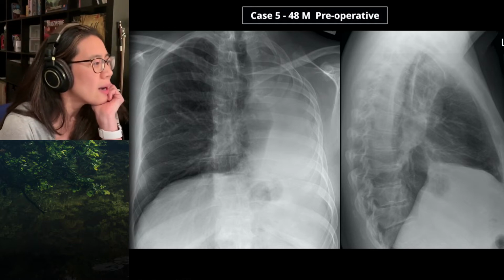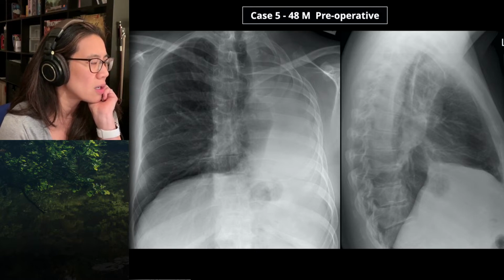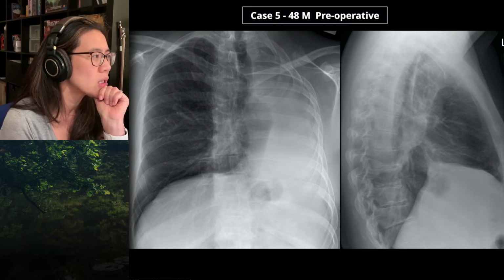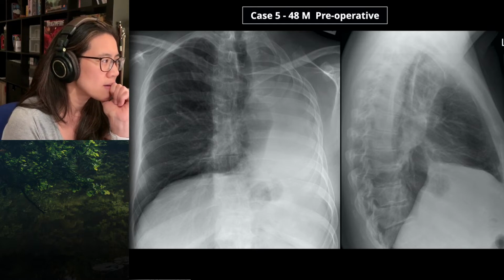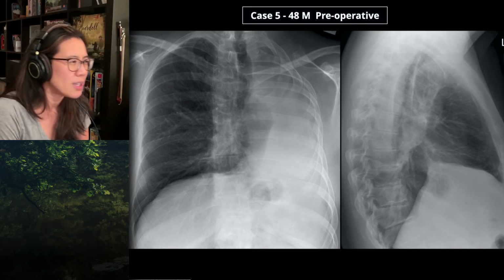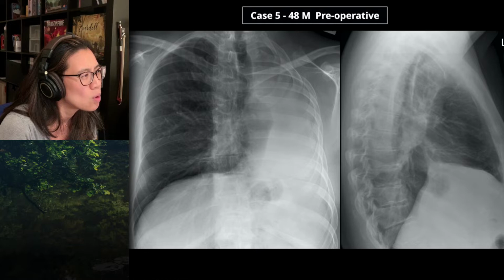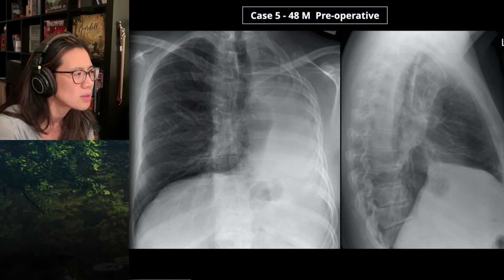All right. So I think there's loss of left lung volume. The question is whether this is iatrogenic or not iatrogenic. Is it a congenital process? Has this person always looked like this would be my first question. Or some sort of childhood lung injury or trauma in the past that's led to this sort of deformity, or any cause of chronic left lung collapse.